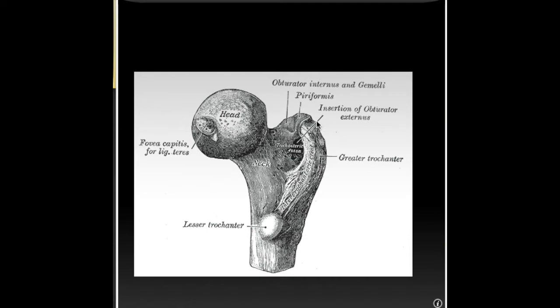So that's another part of the differential when we're looking at single lesions, and they are relatively benign appearing borders. The other thing we need to mention is that as part of this, we're assessing the location, whether that's eccentric, the margin, like I mentioned, also the periosteal reaction. So we don't expect any of the ones that we've mentioned to have an aggressive periosteal reaction. And by that we mean any thickening of the cortex.